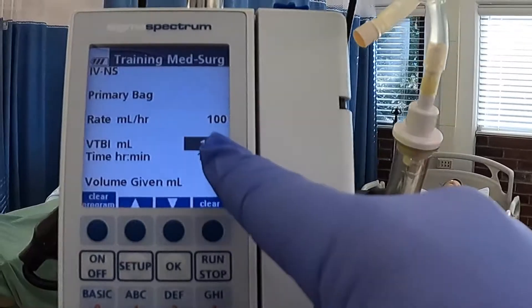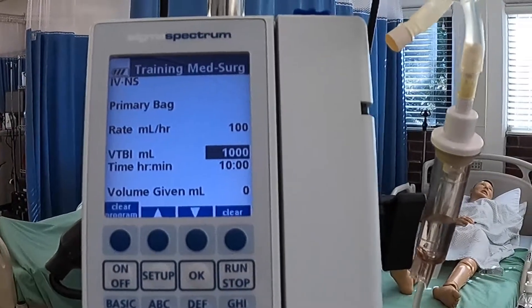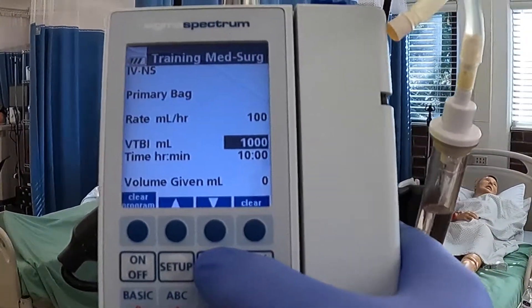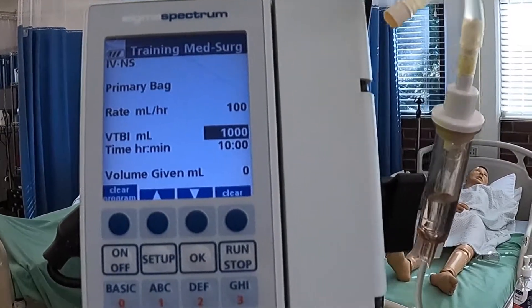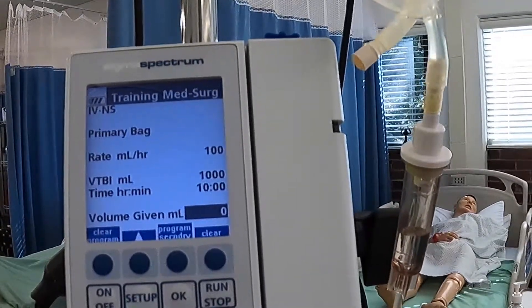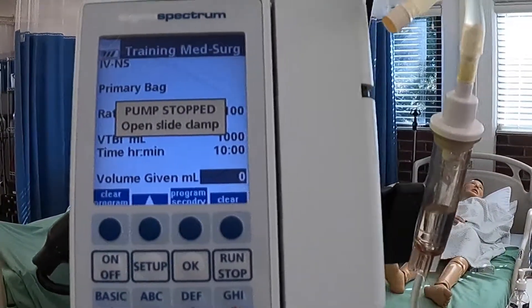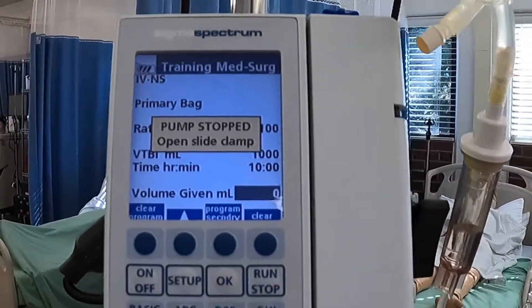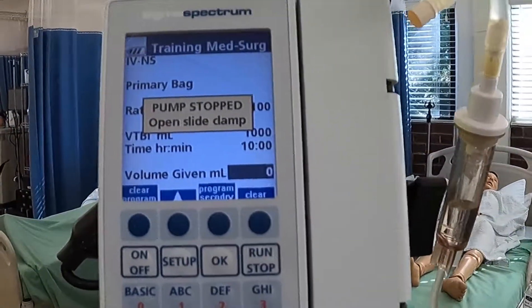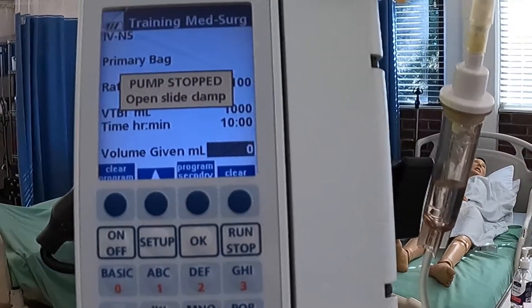This one says 1000, and then it's VTBI milliliters, which stands for volume to be infused — that's how much we're going to be giving this patient. We are going to be giving them 1000, so we don't need to adjust that. But if your order called for 500 milliliters, then you would change it to 500. Underneath it, it says time — it's going to be running for 10 hours. This last one is volume given per mL, and once we get it started, it's going to keep track of how much fluid has been given to our patient. So when we do our intake and output, we'll get it off of here — we'll know that over seven hours we gave him 700 mLs, and then we would clear it for the next nurse.